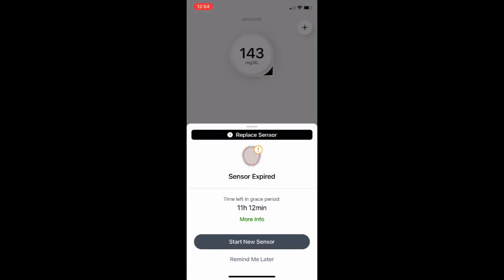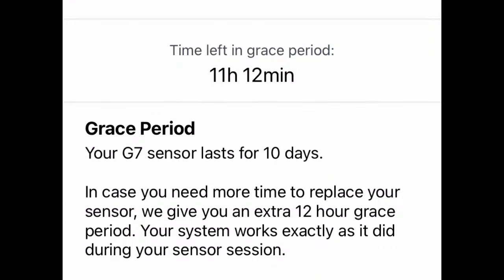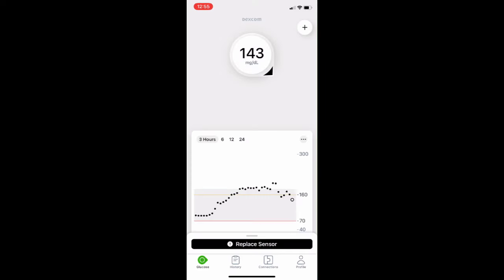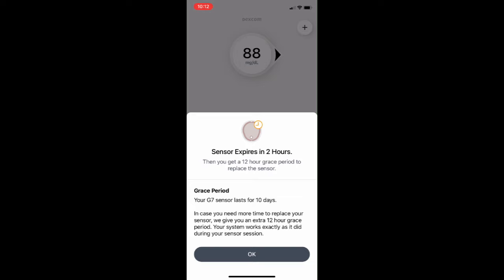After 10 days, you'll get a warning on your phone saying sensor life is up. It's actually a 10-day and 12-hour sensor — you have a 12-hour grace period to change the sensor, and you'll get more alerts, like the two-hour alert. Once the 10 days and 12 hours are over, it will stop sending blood sugar readings to your phone or receiver, and it will be time to put on a new sensor.